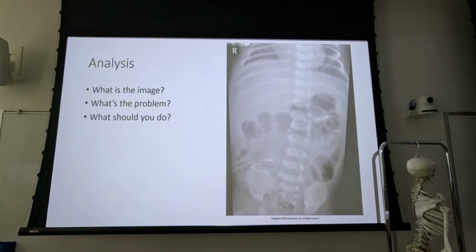Do they see what they need to see? Did we do this specifically for a feeding tube, for the UVC? Do they want the UVC going into the inferior vena cava? Is this a line placement? What are we doing? Do you need to reposition this before I shoot it? Because you can see that it's not going upwards towards the heart. It's just stuck right there.